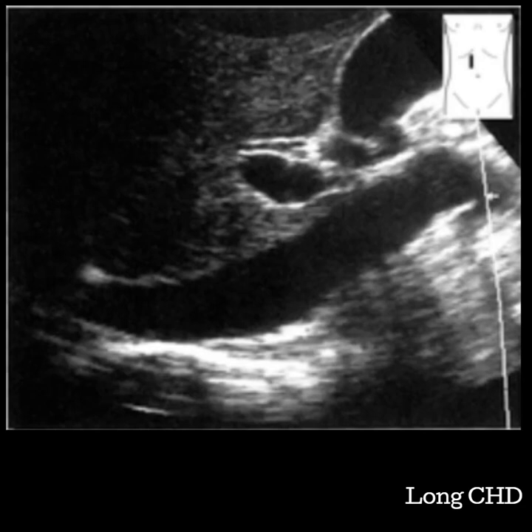It can actually be really difficult to get both the common hepatic duct and the common bile duct all in one image. You should not strive to get them in one, but rather take two separate images of the structures to show these structures completely. Zoom into the porta hepatis and use your color to prove that the structure is a duct versus a vessel.